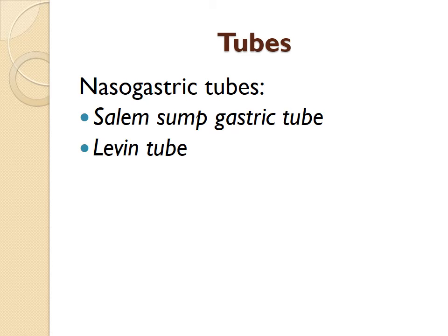The second is called the Sengstaken-Blakemore esophagus tube. Now this has 3 lumens, and the reason for the third lumen is so that a balloon will inflate in the esophagus and gently extend against the esophagus wall. The reason is for esophageal varices. Remember that esophagus is a very thin wall. The blood vessels are very close to the surface.